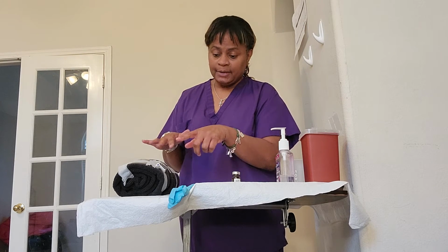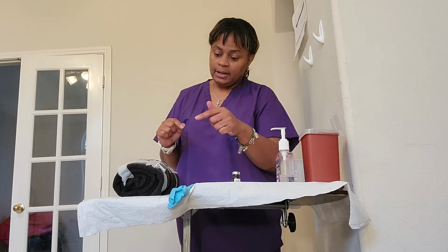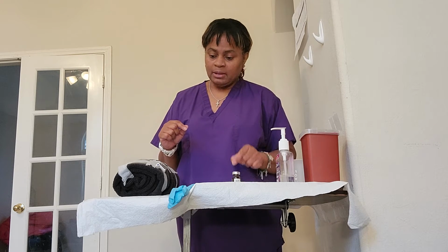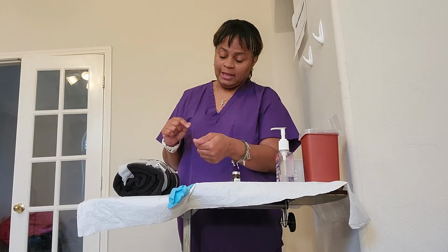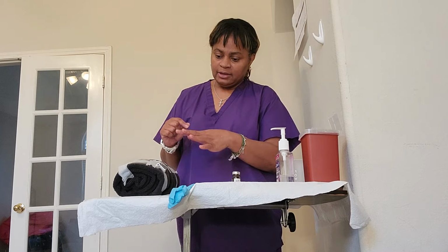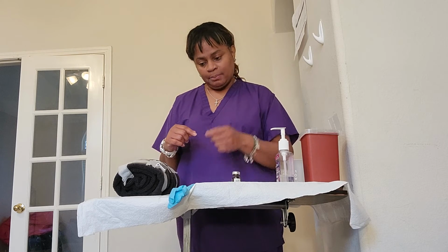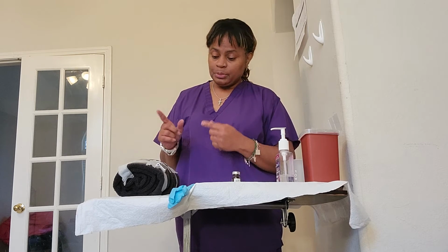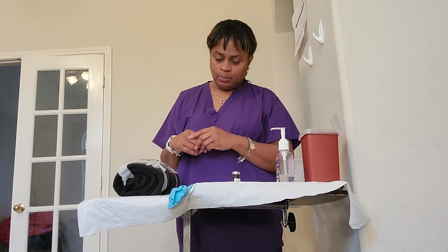assess your IV site, and then I'll take an alcohol prep pad and I'll clean the hub. Then I'm going to put 3 mLs of the sodium chloride or saline flush through your IV to make sure that your IV is patent and everything like that. We'll push that through there, okay? Afterwards, I'll administer the furosemide over a 2-minute period, okay? And then I'll take it off again. I'll clean the hub once more.